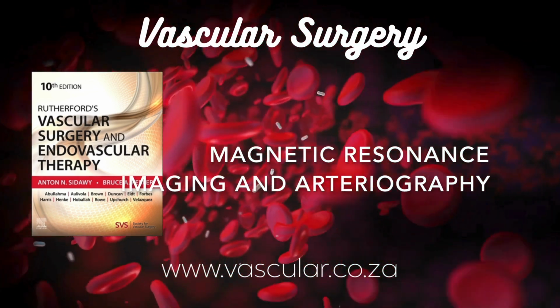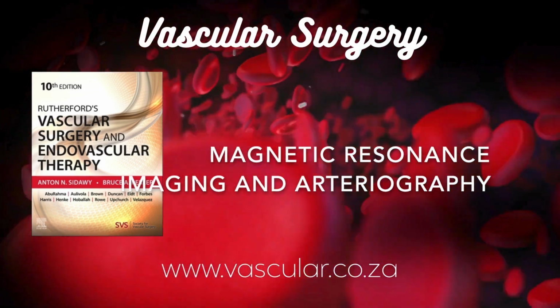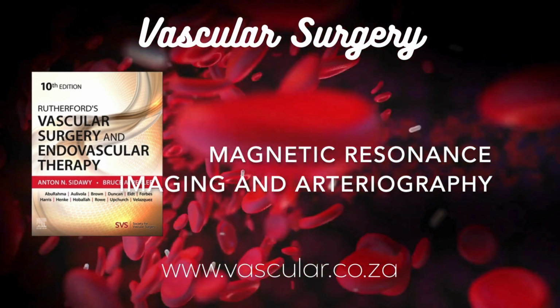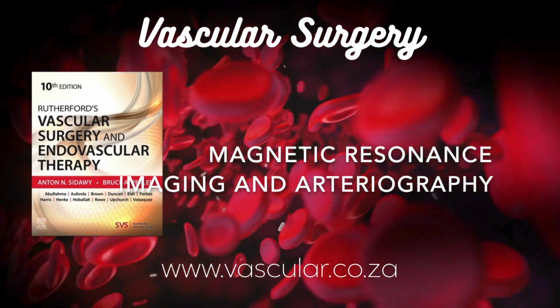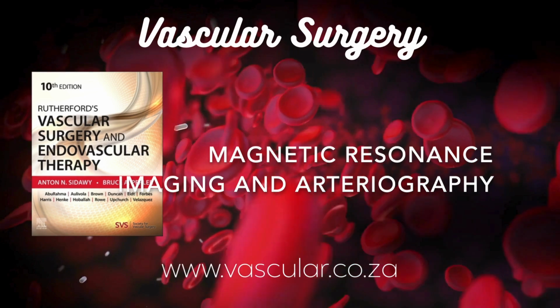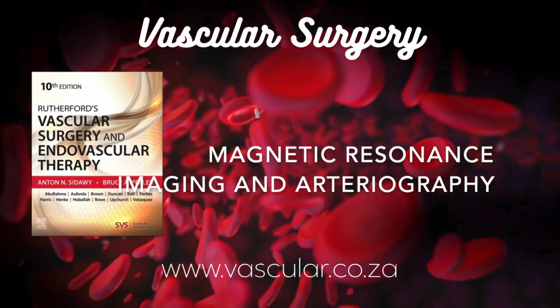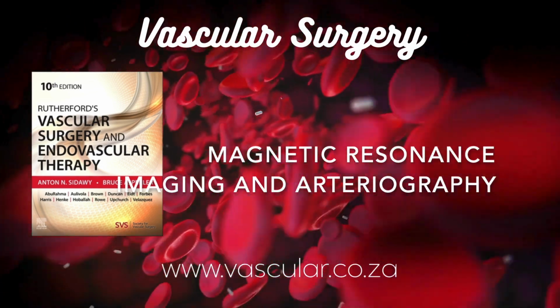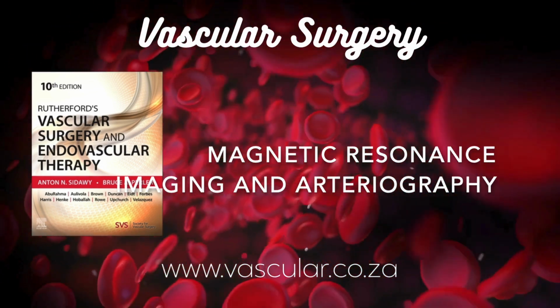That way, the arterial blood flowing downwards into the slice remains bright, making the arteries stand out more clearly. Flip the saturation band to be above the slice, and you'd suppress the arterial signal and highlight the venous flow coming up. So you can choose whether to see arteries or veins better just by placing these saturation bands. Precisely. You can selectively enhance one or the other.